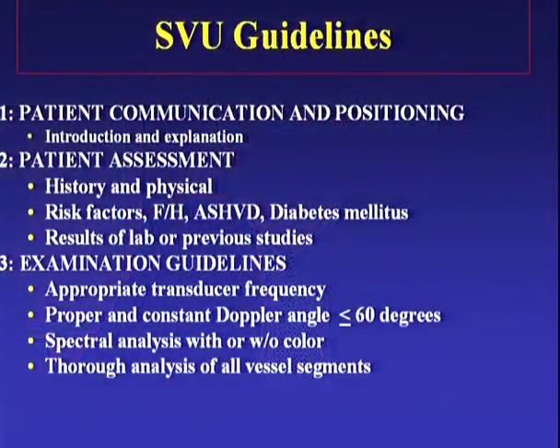The patient assessment is when you are looking for past history on this patient to help you get through your examination, to make sure, A, you're doing the right exam, and B, that the patient has given you a full analysis of what they have or had that brought them to your lab at this time. You will go over the risk factors and the results of previous studies, which I believe is very important, going back in the patient's data to see if they've had similar or other tests that would be complementary to helping you find whatever the patient came into the lab for.